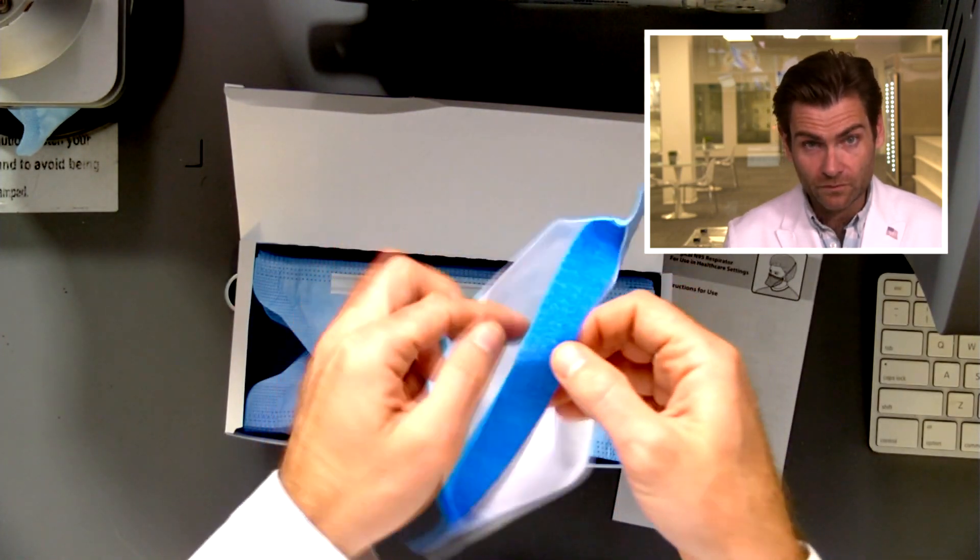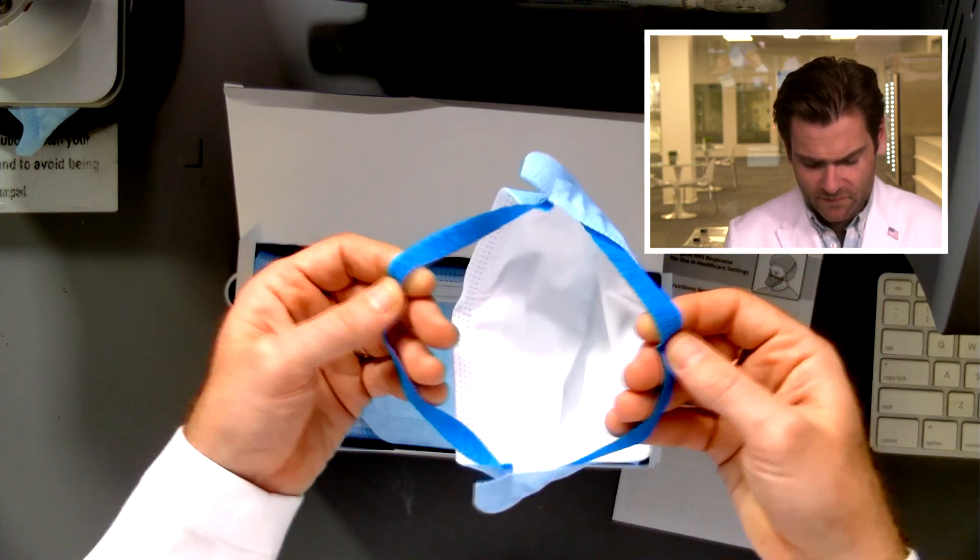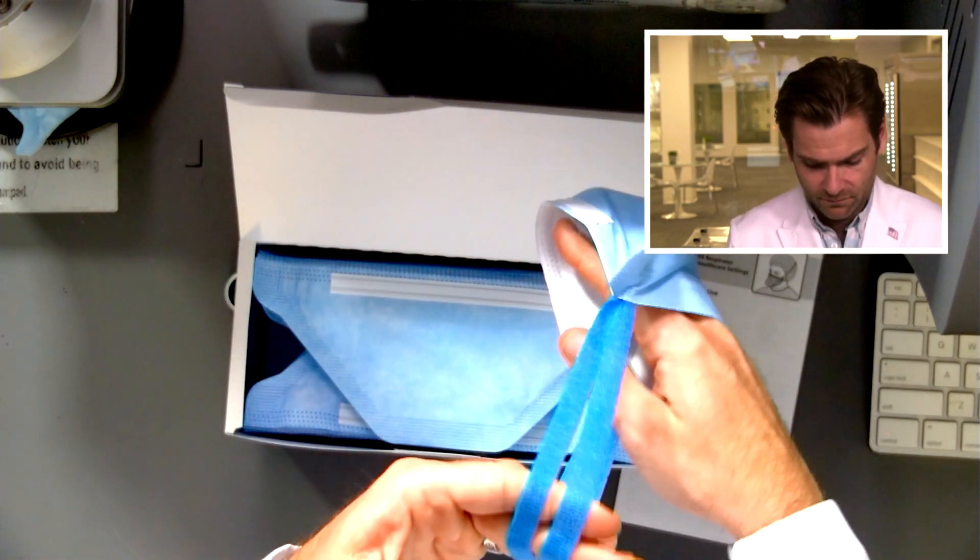And then just open it like this — oh, that's like that surgical tape stuff. Interesting.